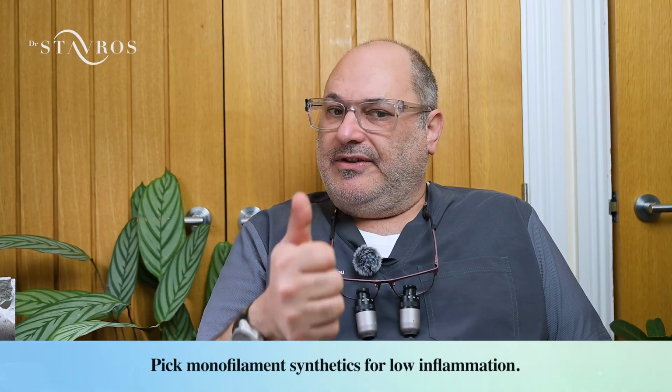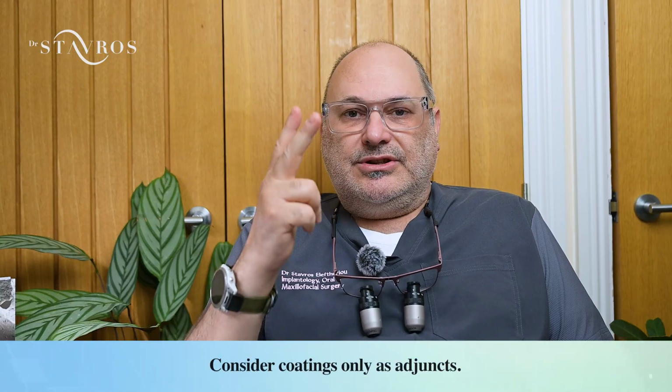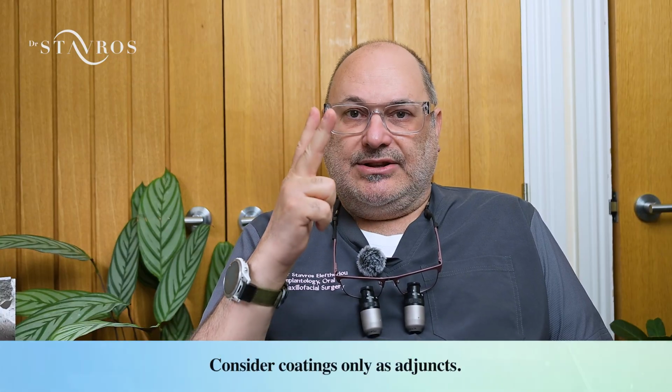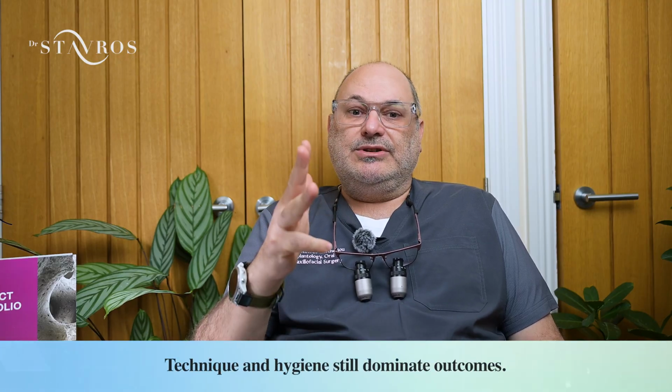So bottom line, pick monofilament synthetics for low inflammation. Add throws for security. Consider coatings only as adjuncts, and technique and hygiene still dominate your outcomes.